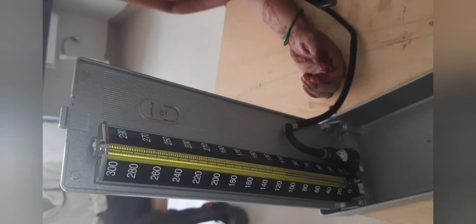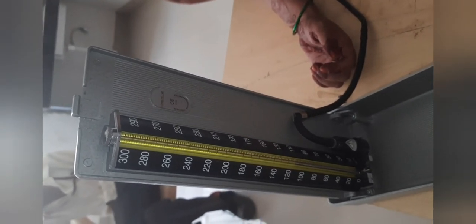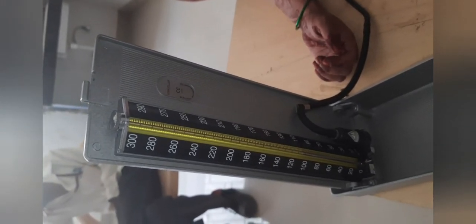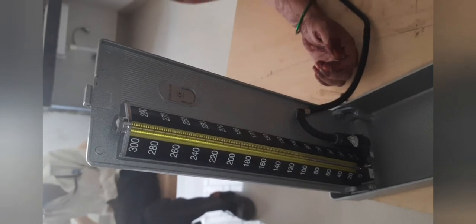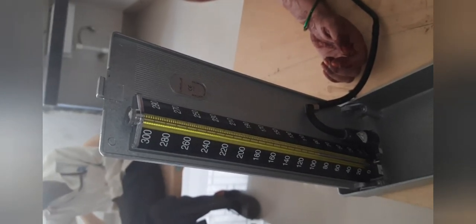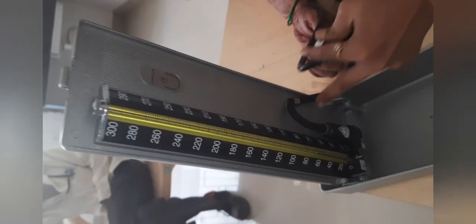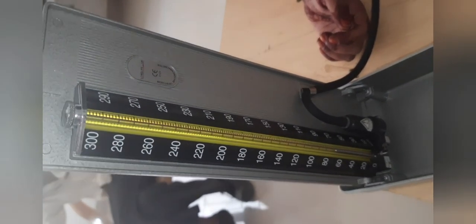The first sound was heard at approximately 118, so the systolic pressure is 118 mmHg. Continue to slowly release the pressure until the sound disappears — when the sound disappears, that is the diastolic pressure. The sound stopped at 80, so the diastolic blood pressure is 80 mmHg. In this practical, we observed the systolic pressure is approximately 118 mmHg and the diastolic pressure is 80 mmHg. Thank you.